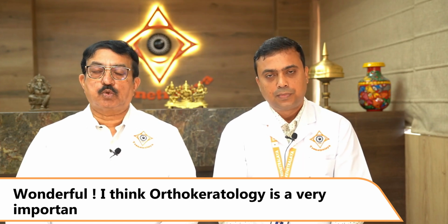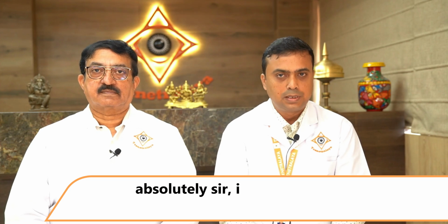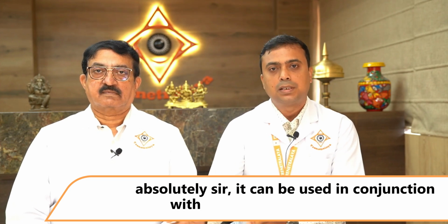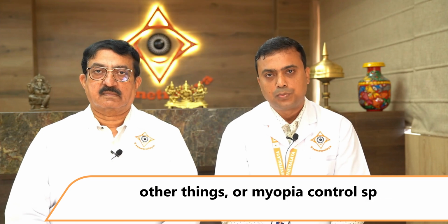Wonderful. I think orthokeratology is a very important domain in every eye hospital. Absolutely, sir. It can be used in conjunction with other therapies like atropine and other things, or myopia control spectacles.